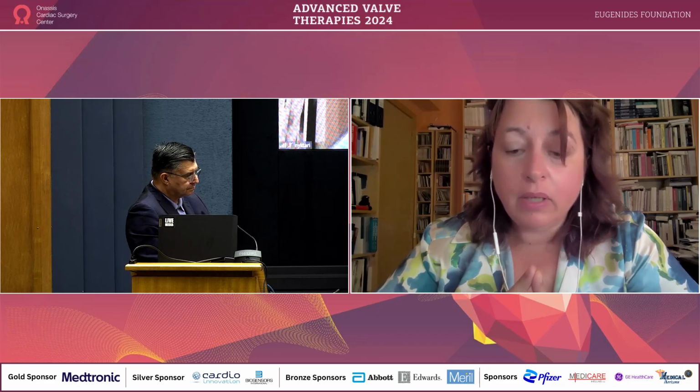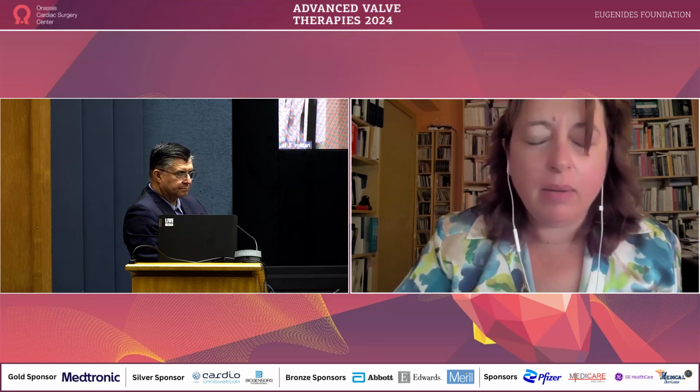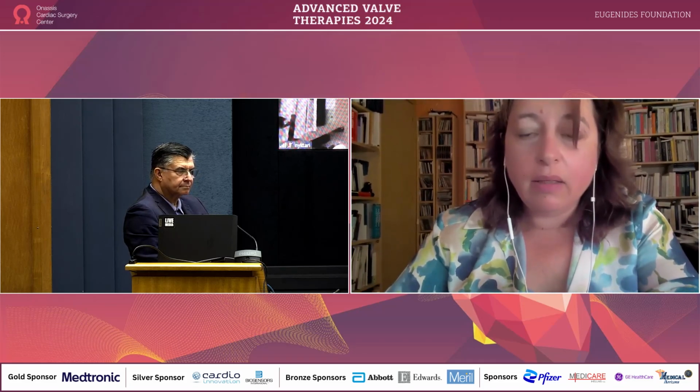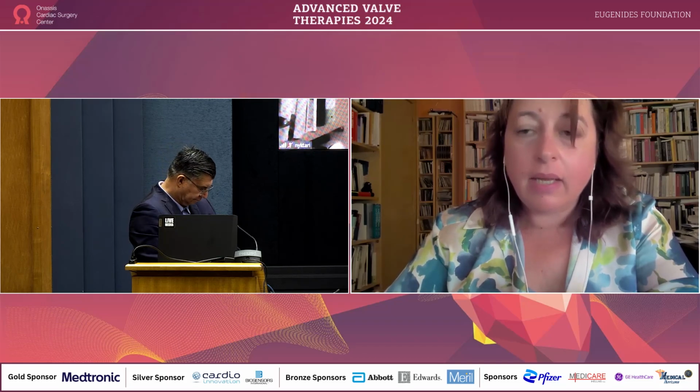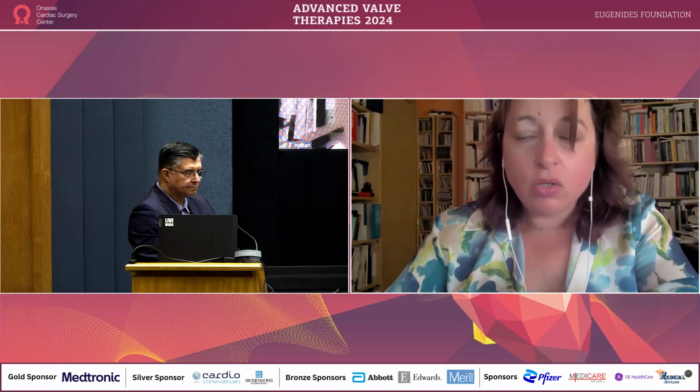To comment on the value of cardiac MRI, because I have been performing cardiac MRI for the last 10 years, I have to say that it is an option in frail patients whenever you want to avoid radiation or contrast.